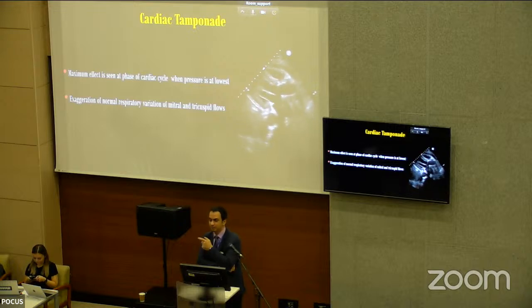Mostly see it. Is it pleural or pericardial? Who can say pericardial? Okay, who can say pleural? So the majority pleural, which is correct.